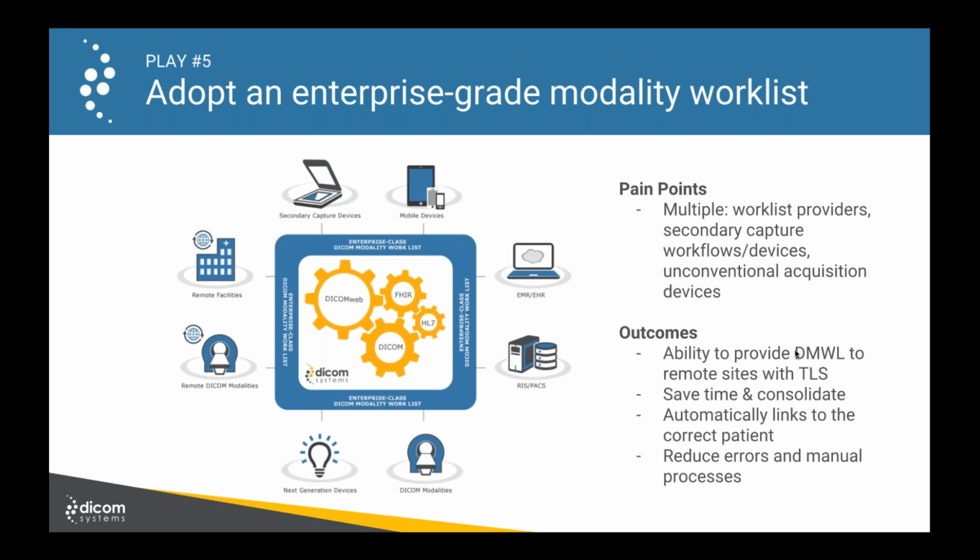Even two separate instances of an Epic EMR within the same health system. We ran into that with one of our customers in Northern California. They have Epic in two different hospitals that belong to the same health system, and they have some pretty dramatic differences within their Epic implementations. And so that has a direct impact on our ability to provide Worklist in those two organizations.